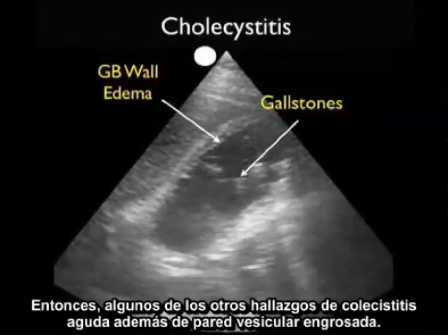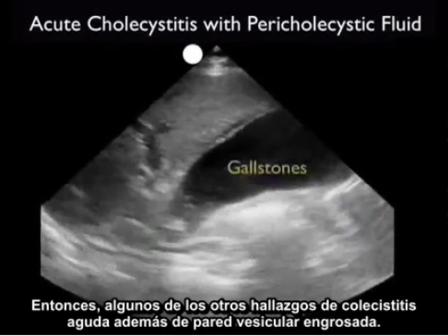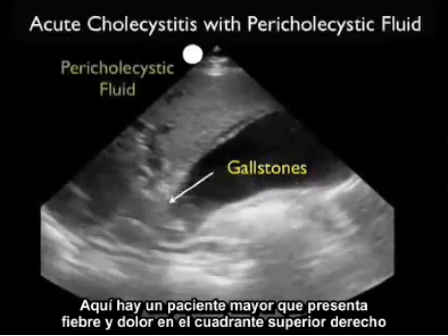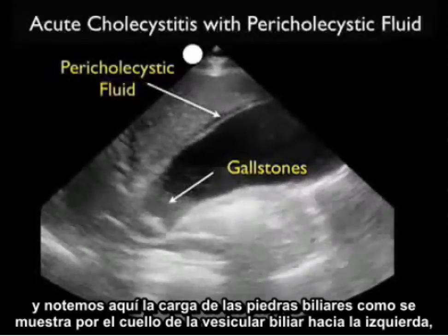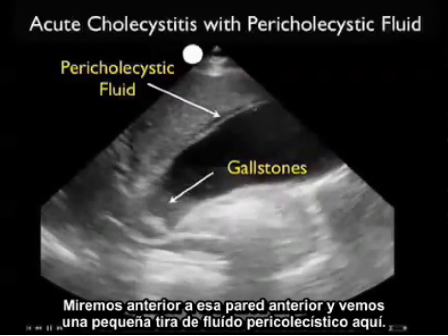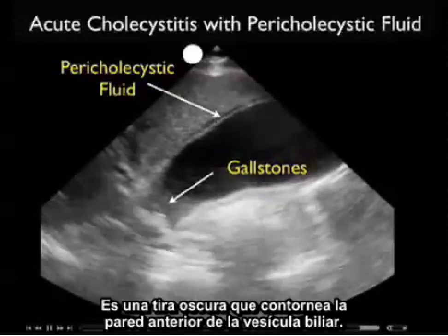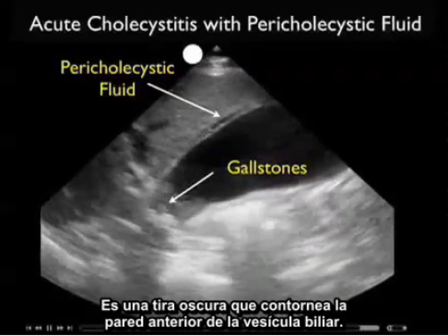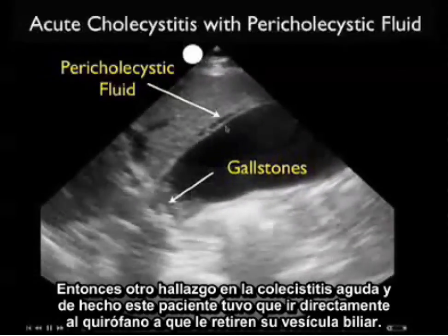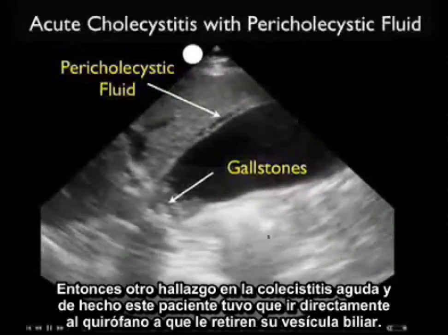So some of the other findings of acute cholecystitis in addition to a thickened gallbladder wall: here's an elderly patient presenting with fever and right upper quadrant pain. Notice here the significant burden of gallstones down by the neck of the gallbladder to the left. But let's look anterior to that anterior wall, and we see a small stripe of pericholecystic fluid — that dark stripe outlining the anterior wall of the gallbladder — another signature finding in acute cholecystitis. In fact, this patient had to go directly to the operating room for removal of the gallbladder.